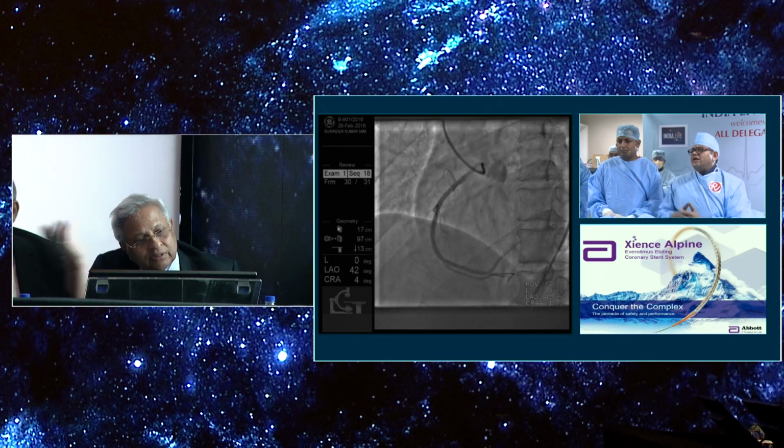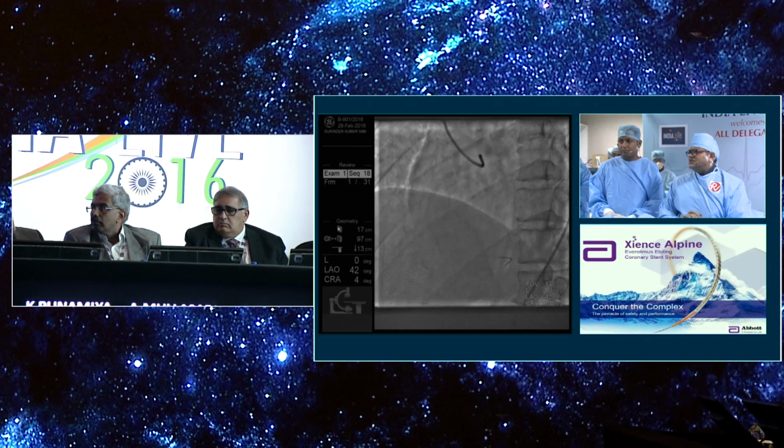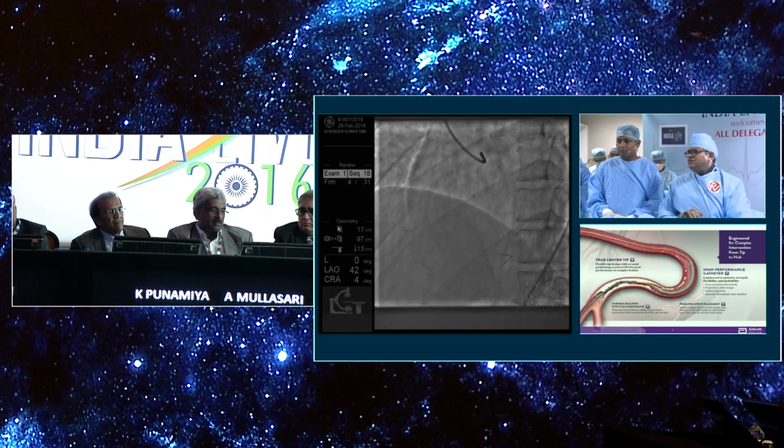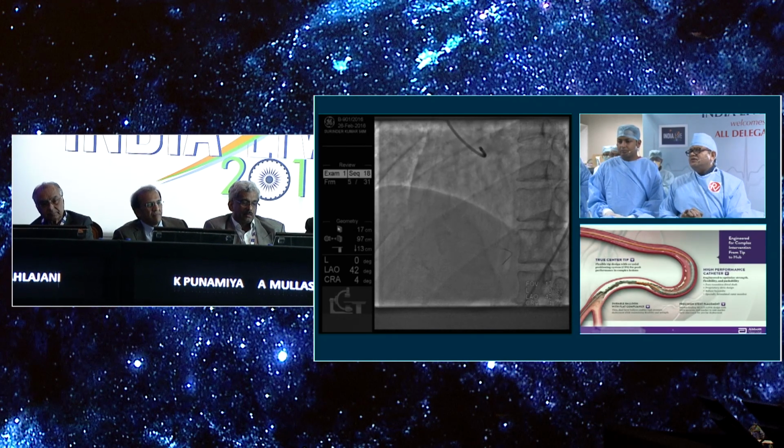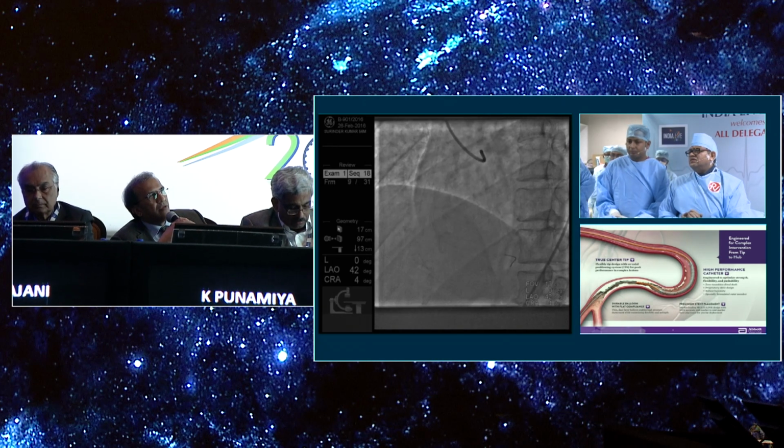It's been dilated at 3 with the 3.5. IVUS does show a well-opposed stent proximally as well. Do you feel I should dilate it with 4 millimeter? No, you have an IVUS. Why don't you look at that IVUS? You did an IVUS, didn't you?